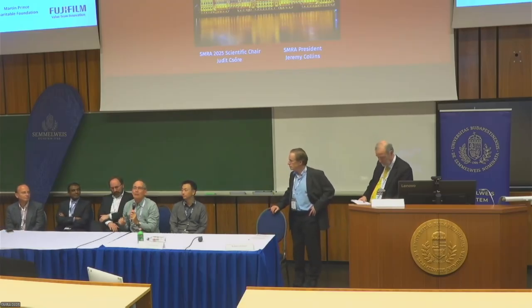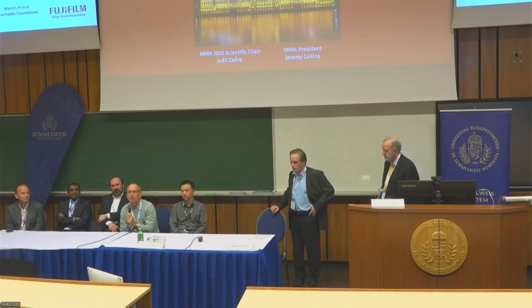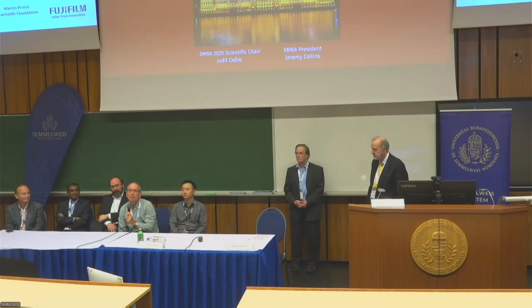Well, first of all those acquisitions are 3D. The native T1 and the LGE are basically the same sequence. They're 3D scans, native inversion recovery, typically 5 minutes to 10 minutes. But that said, yes, of course, especially when you saw the patient scans, the images still look kind of cruddy. So yeah, work on motion compensation is going to be important.